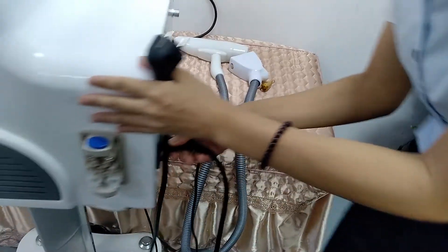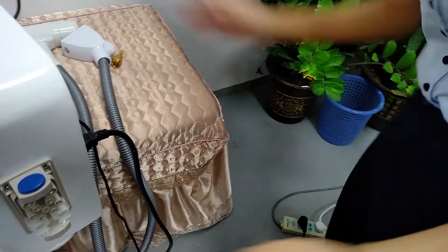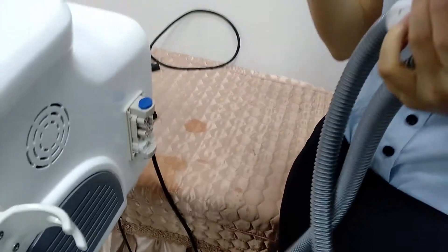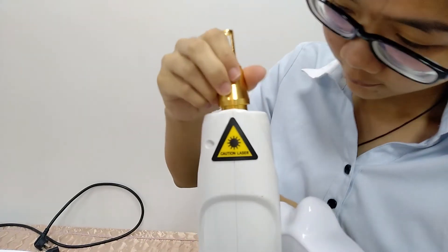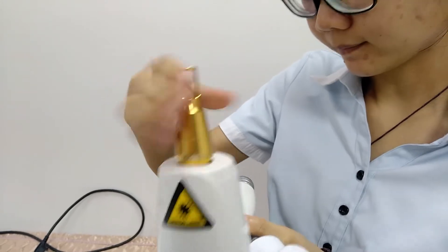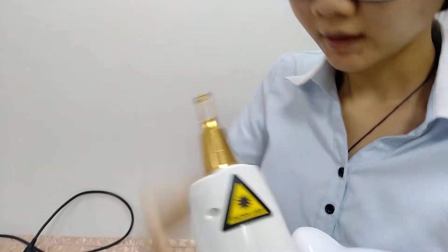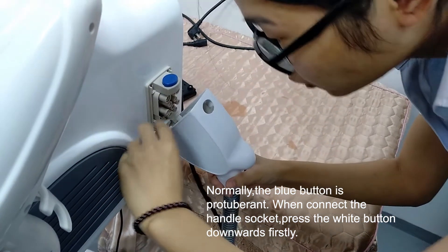We need to connect the power on the device, and then we need to connect the proper handle. This is the 1064nm probe. First, we need to connect it. It is okay, and then we connect the handle. The handle connect order is bolted from top, with the two holes.